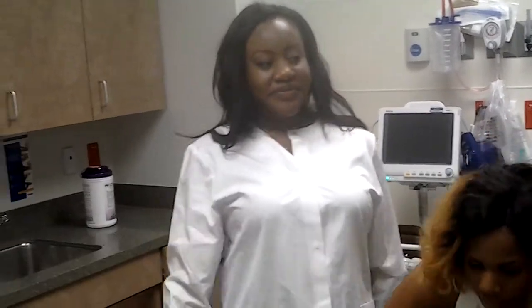So the next thing I'm about to do is I'm going to have my patient read the Snellen chart to look at her visual acuity. She's going to stand at 20 feet away from the chart, and we're going to start at the 20/20 vision. I'm going to ask her to cover her left eye first. Alright.